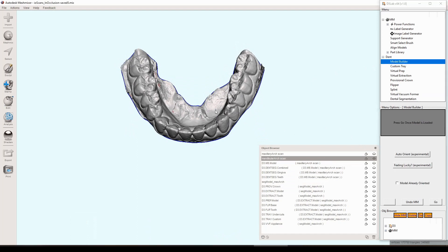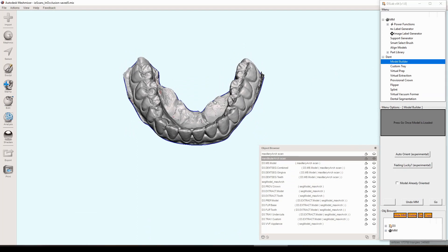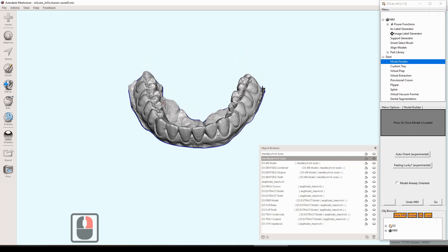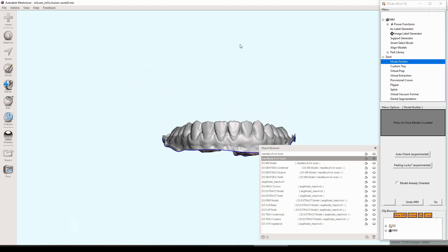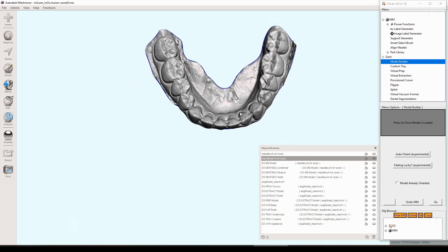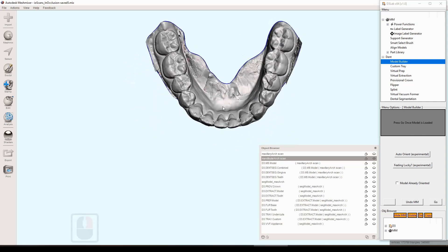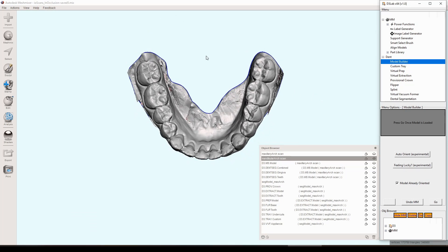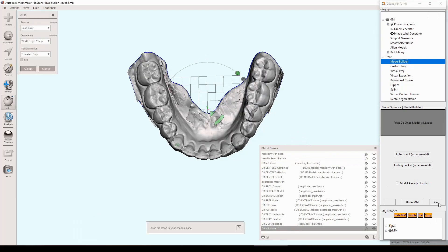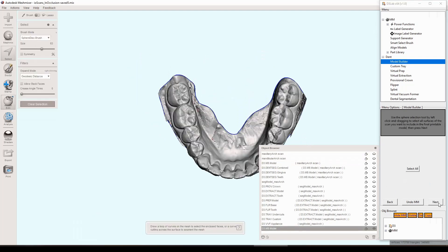Also we're going to point out one quick thing. At this initial step when you load the model builder, there's a checkbox there that says model already oriented. What this does is if you are certain that your model is already in the proper orientation, you can check that box and it will skip those first several steps of orienting the model.